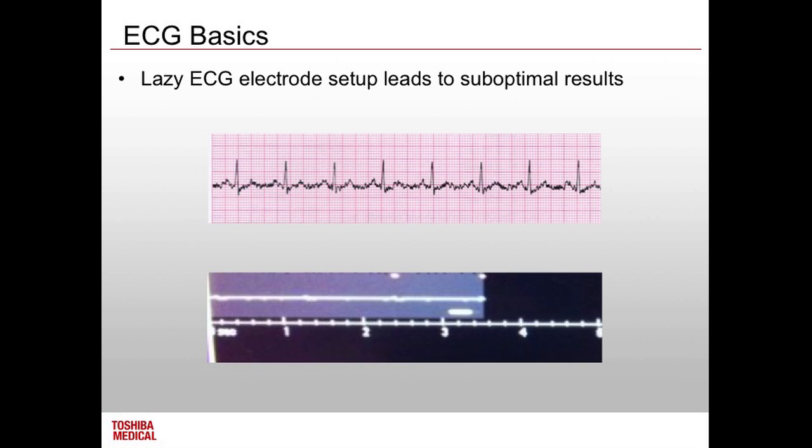And this is just showing you getting some interference on your ECG trace. So being able to pick those things, I guess, is important. That said, there's still some pretty good R peaks on that. If I couldn't work out what the interference was, I'd still scan on that.